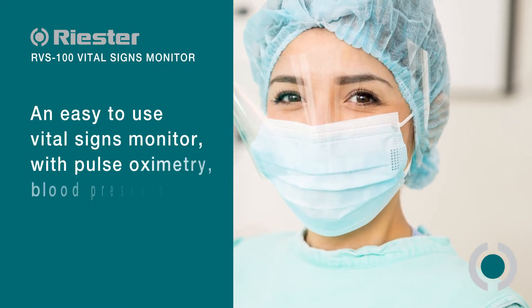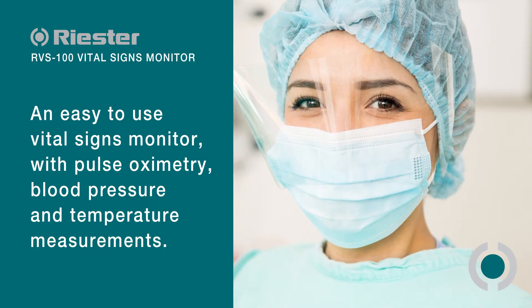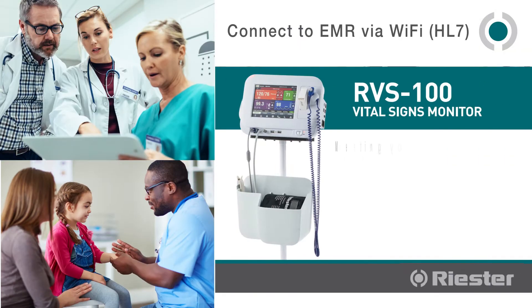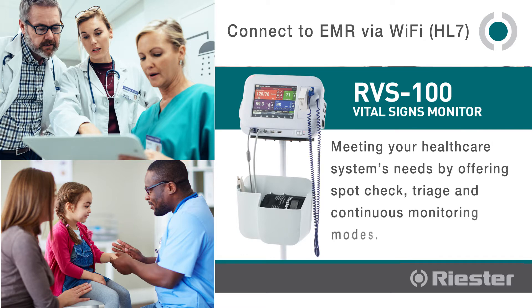An easy-to-use vital signs monitor with pulse oximetry, blood pressure, and temperature measurements, meeting your healthcare system's needs by offering spot check, triage, and continuous monitoring modes.